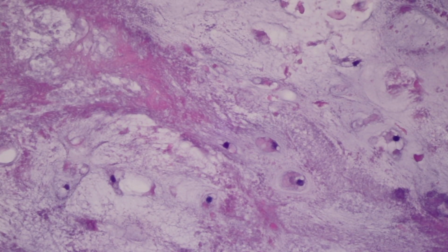And when I use the term cytological features, I am not referring to the size of the chondrocyte. I am referring strictly to the nucleus. A normal chondrocyte nucleus will look like a lymphocyte. So if we went back to articular cartilage, you look at a chondrocyte nucleus, it looks like a lymphocyte. Enchondroma, the nuclei are small, round, and dark, just as we see here.